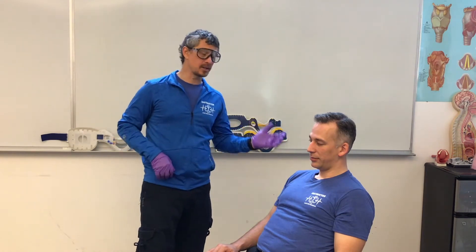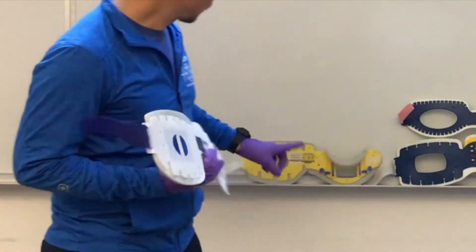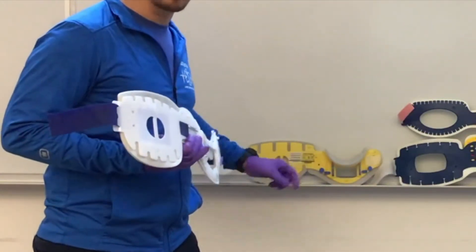Welcome back. Today we're going to talk about application of a C-collar. Application of a C-collar is a small piece in a larger skill, such as supine spine or KED. But right now we're just going to focus on application of a C-collar. We're going to look at a couple of different brands — we've got an Ambu or the Lairdol. They come in an adult size and a pediatric or small adult.